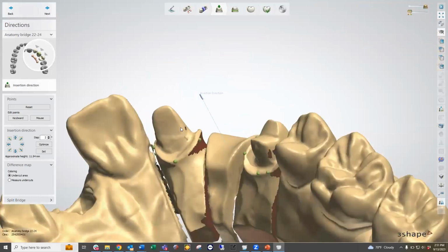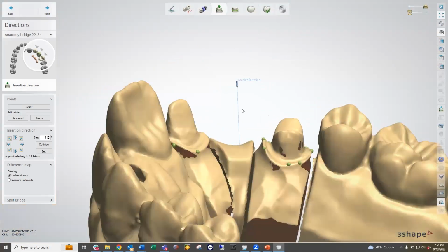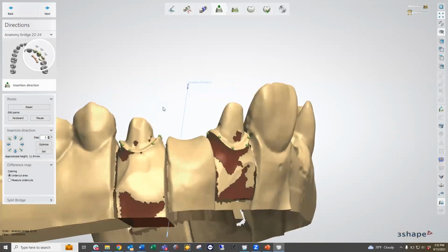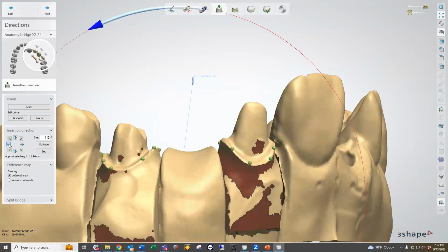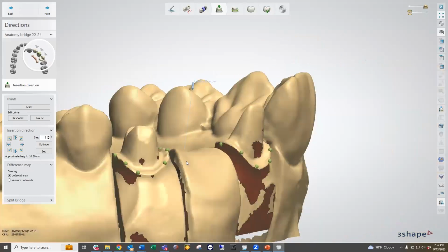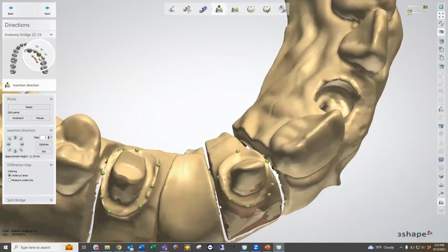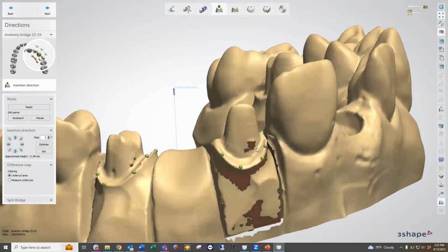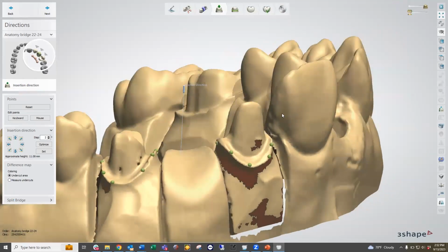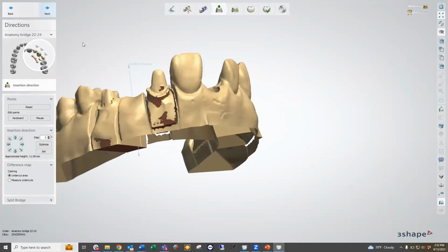So here we're again surveying our case to make sure that this insertion path is correct, not only for our axial walls, but also for our neighboring teeth as well, to ensure that we're not putting in an insertion path that's not going to be feasible based upon the insertion of the unit into the patient's mouth. So I'm actually going to guide this a little bit more distally, just to have it look a little bit better. And actually, I might drag it just a little bit more buccally as well, just to minimize the undercuts on our axial wall and our neighboring teeth. So that looks like a good insertion path for me. Looks true to the design that we're looking for. So I'm going to go ahead and click next.